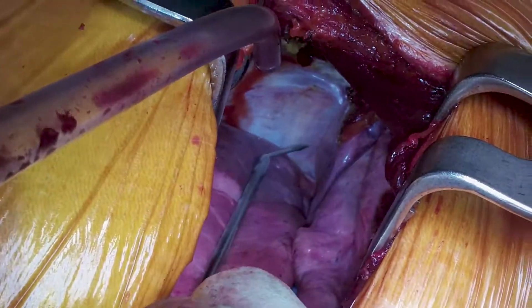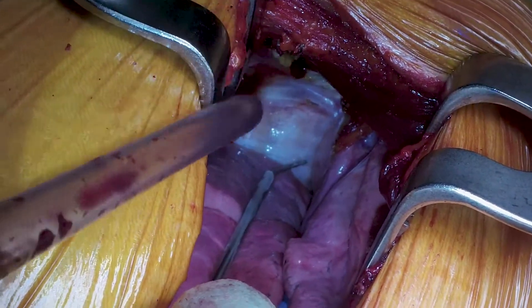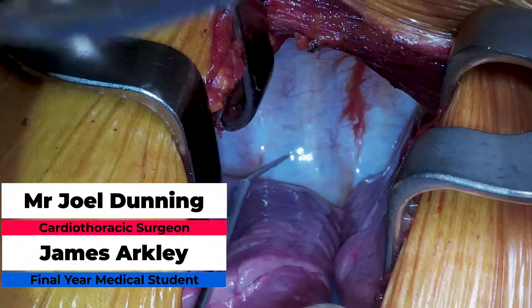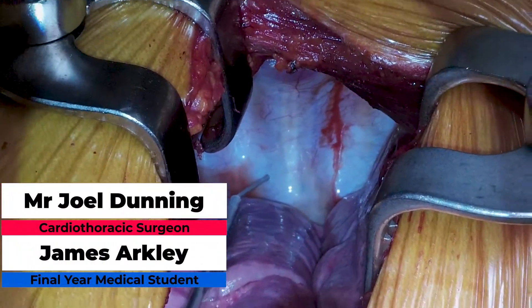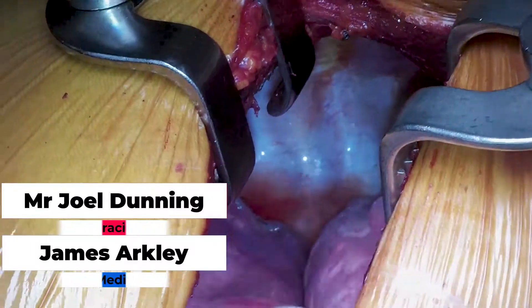This is the second part of the upper lobectomy lung cancer video. The first part covered the anterior lateral thoracotomy to get into the thorax, and this part covers the actual removal of the lung cancer. It's the exact same surgical team as before with Mr. Joel Dunning as the chief surgeon and myself, James Arkley, assisting in the operation.